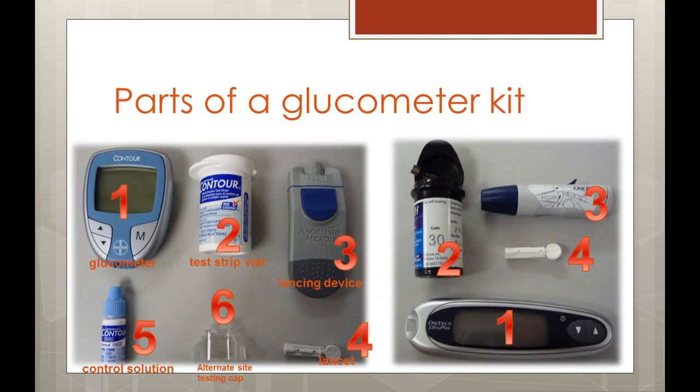A standard kit is generally composed of four integral parts. First, we have the glucometer itself. Second, we have a vial of test strips. Next, we have the lancing device, which is used to break the skin to get blood for the test. And finally, we have the lancets that are made to be used with the lancing device.